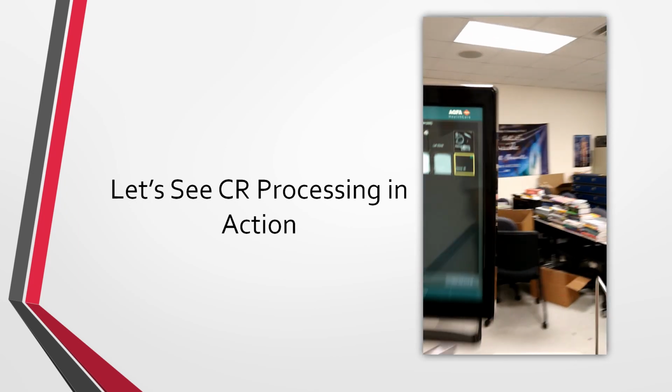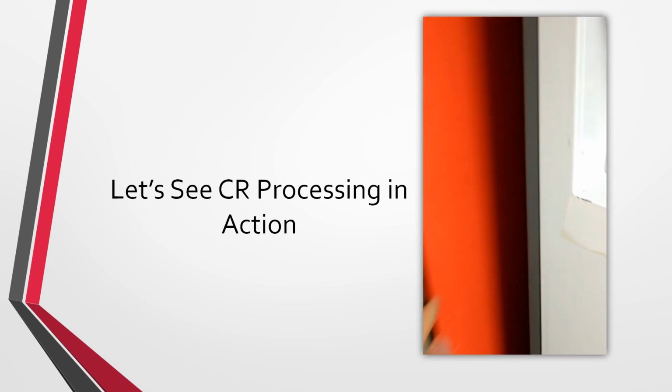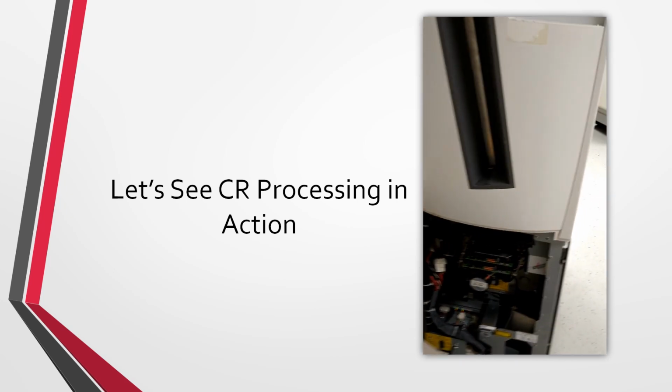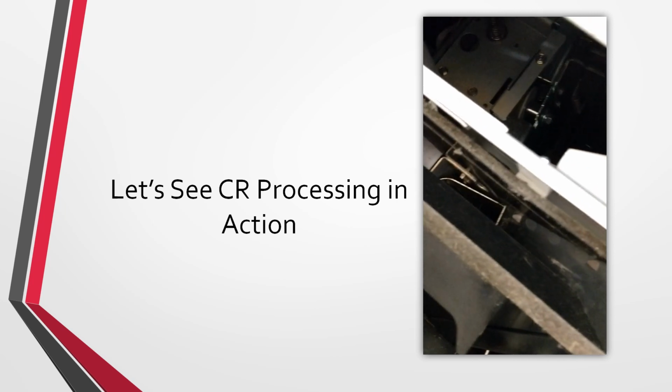We're going to flash it under an exam. This puts the patient information on it. It also says what exam and what image is being done. This is going to change how the computer processes the image data through algorithms. We'll talk about that in later videos.